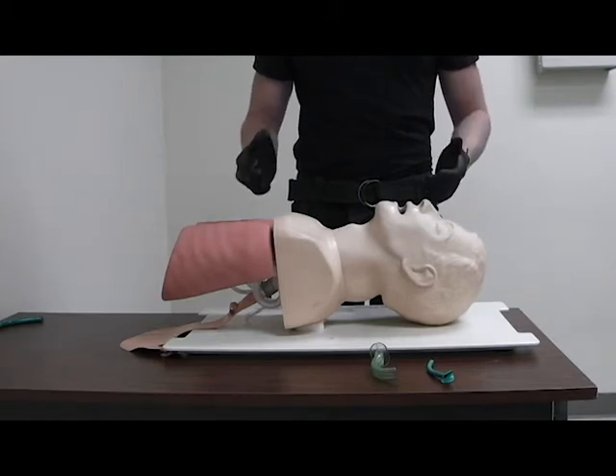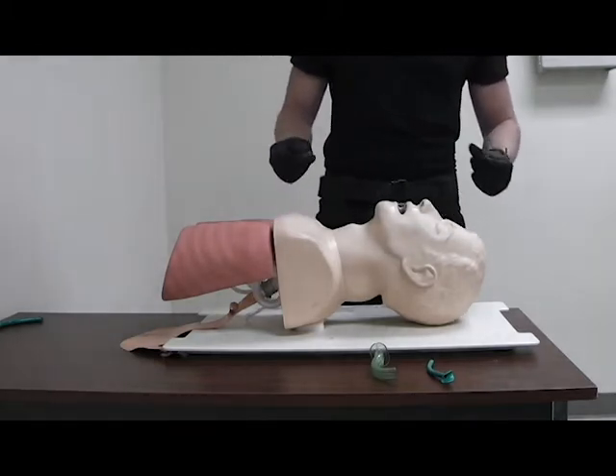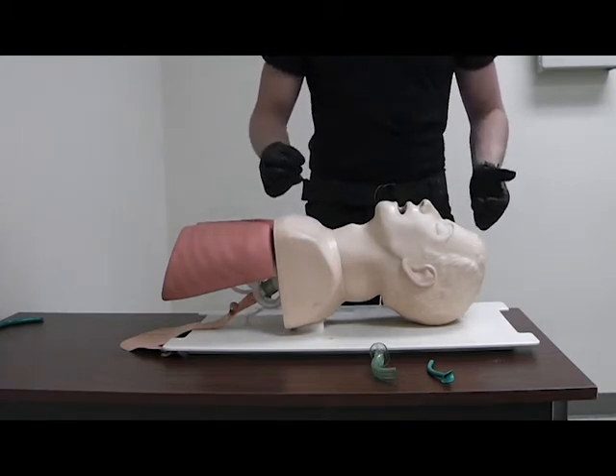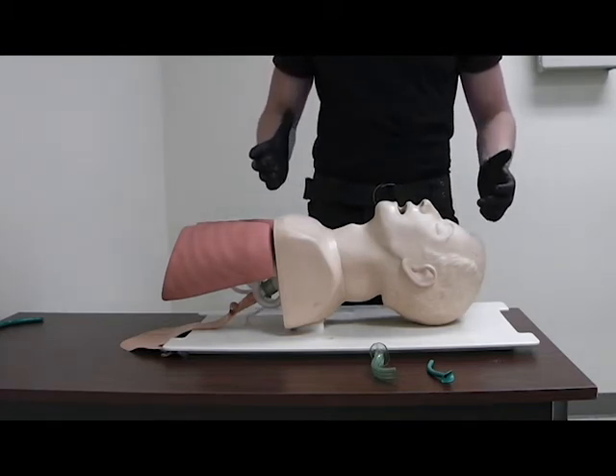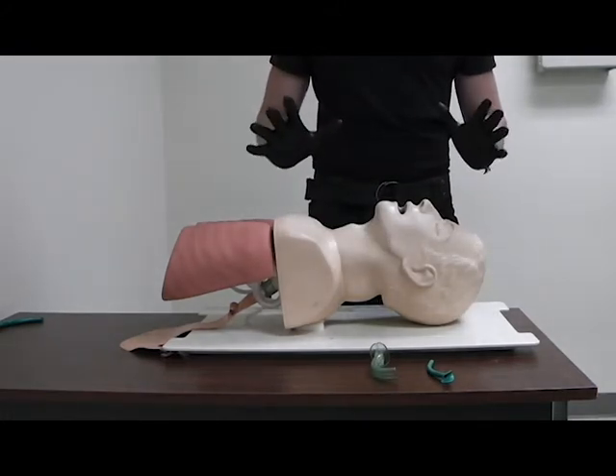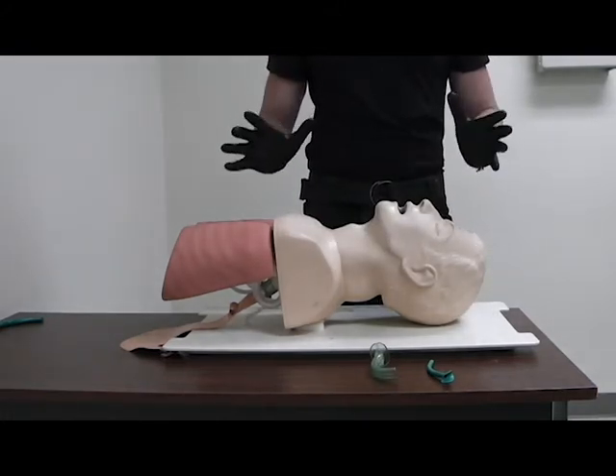This is a demonstration of oropharyngeal and nasopharyngeal airways for airway support. For an apneic, unconscious patient, you want to ensure you have PPE and BSI and that the scene is safe.